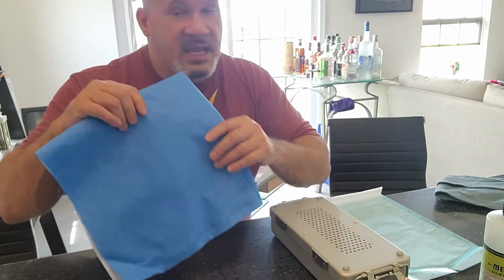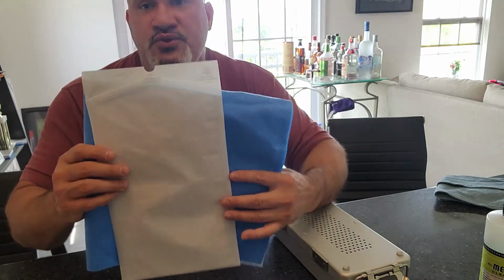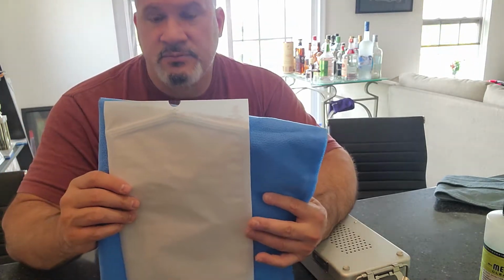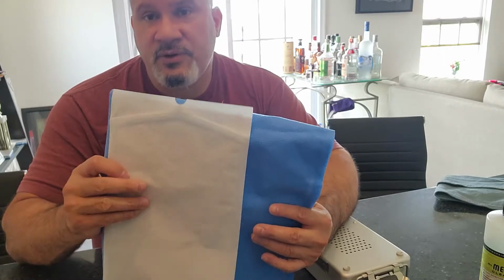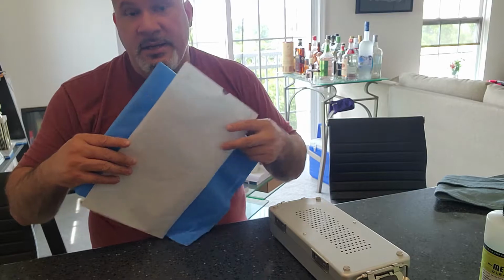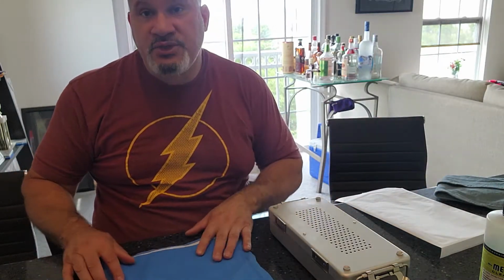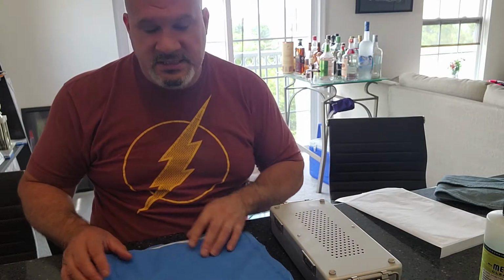This specific company's container has only been validated for the 250 gravity cycle. It has not been validated for 270. When I reached out to the manufacturers, they said, no, validated for 250, not 270. So make sure you guys first look into that.